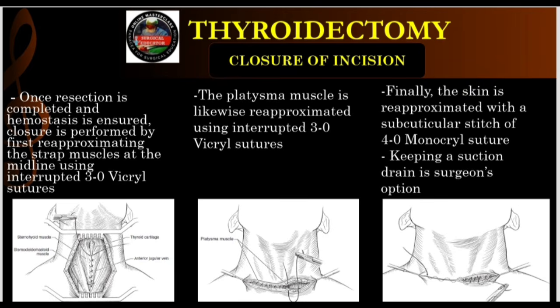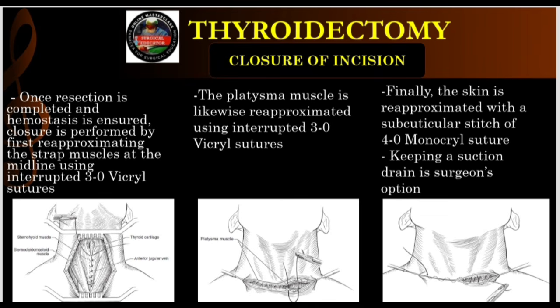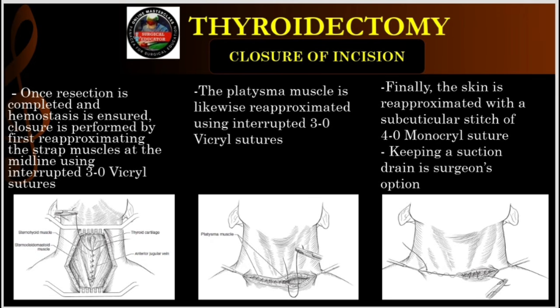Slide 18 also mentions an option for a suction drain. Yeah, if you removed a massive goiter, you leave a giant dead space. Fluid wants to fill that space, creating a seroma. A pool of fluid that bacteria would just love to infect. So you slide a perforated silicone tube in, hook it to a vacuum bulb, and suck that fluid out continuously so the tissues can heal together.